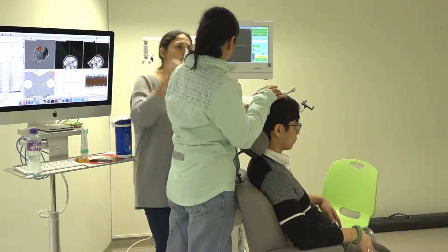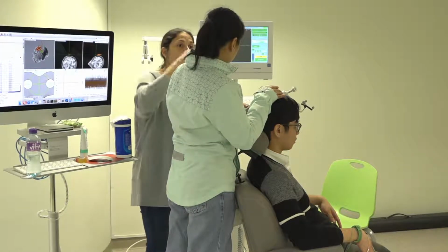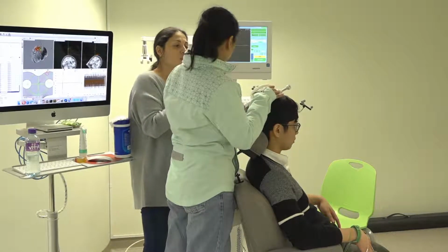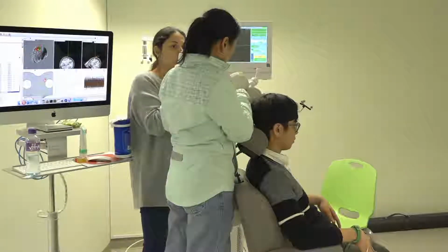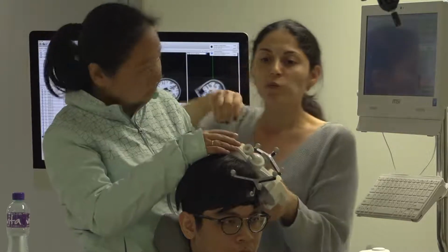I was just paying attention to all the equipment, but when you want to find the motor hotspot, the first thing you want to see is that you can move the finger. If you don't, you also check what happens here in the EMG. So you don't know where to put the coil, right? Yeah, I just know that I shoot this focal point to where I want to search.